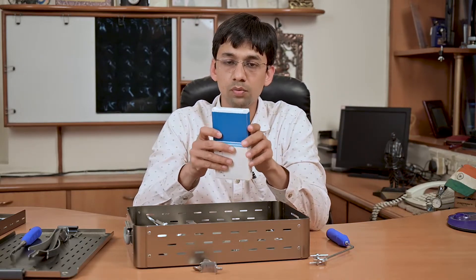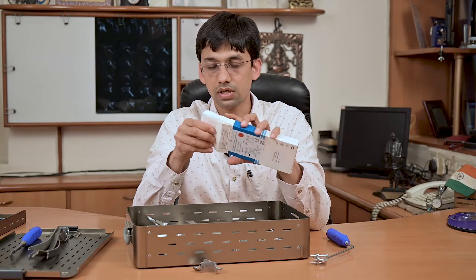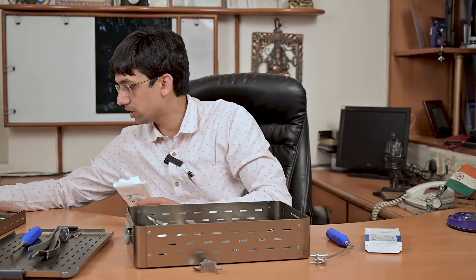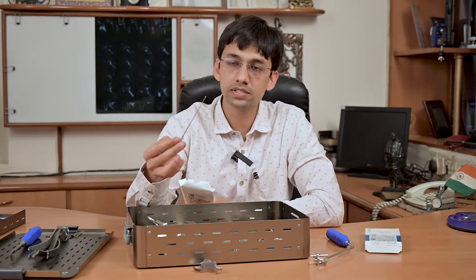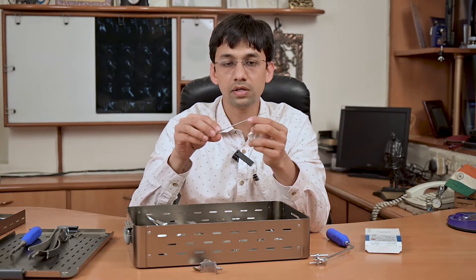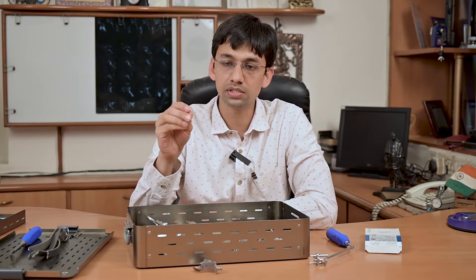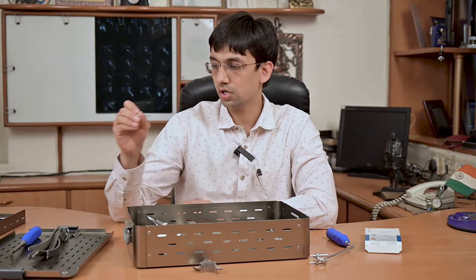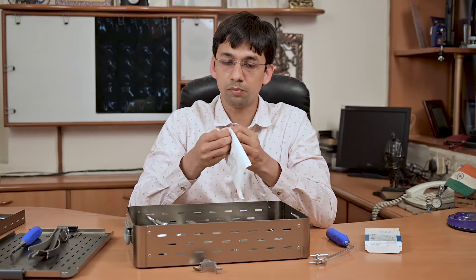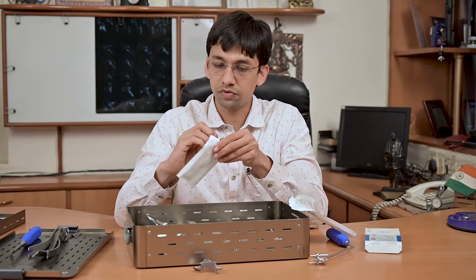The screw comes in a pre-sterile pack. It is 3.75 millimeter in diameter and comes in different sizes. To measure the appropriate size, we have an instrument known as a depth gauge — it has a ball tip, serrations, and calibrated markings. Once you drill into the coracoid and the glenoid, you insert this depth gauge, measure the required screw size, and open the corresponding pre-sterile 3.75 millimeter screw for graft fixation.